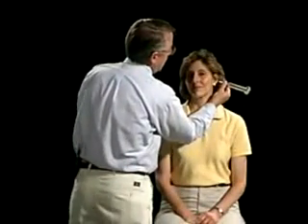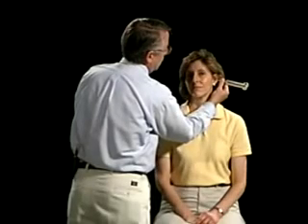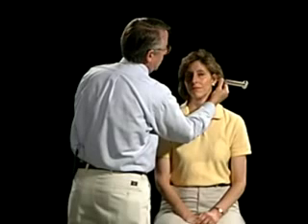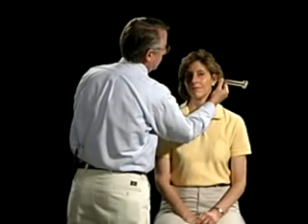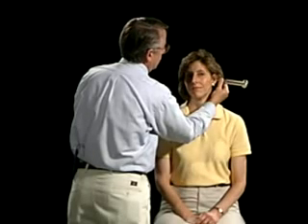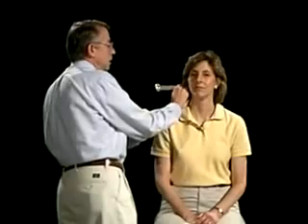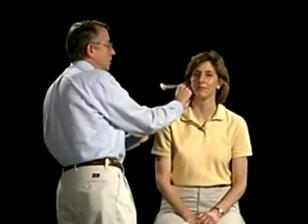And then the Rinne — we're placing it back on the mastoid. Can you hear that? Can you tell me when you can no longer hear it? Can you hear it now? Yes. Another way to screen with the Rinne is to ask the patient which is loudest: number one at the mastoid, or number two, air conduction? Number two. And that's the correct answer — that would be the normal response.